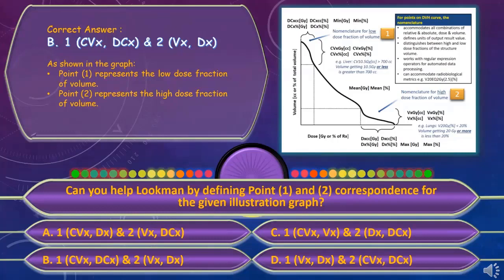Yes. For our experience, as I said before, in the beginning each physician had his own structures, which was really time consuming for every one of us. Because let's say if I took a plan of Dr. X and I start to work on it, and he said, no, this is not my structures. I need to have this and this and this drawn. Why did you not include them? So you start to be confused. You don't know which physician you have to follow.